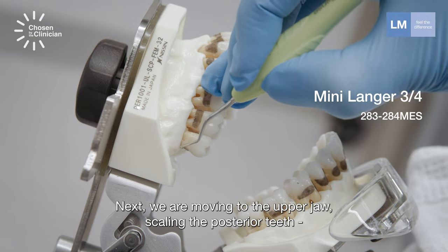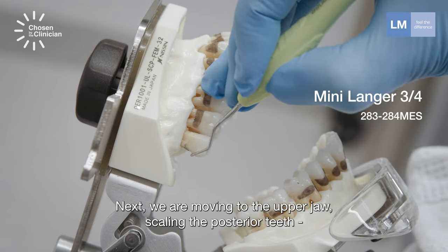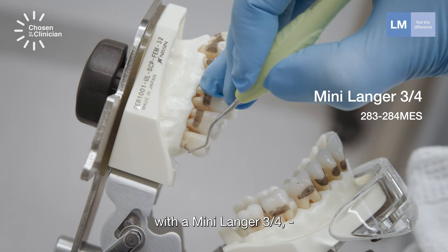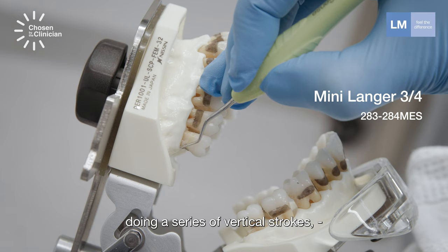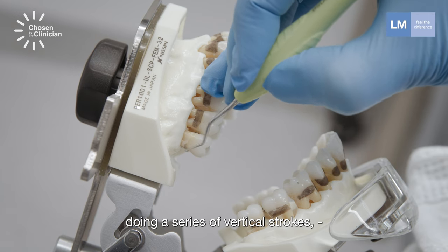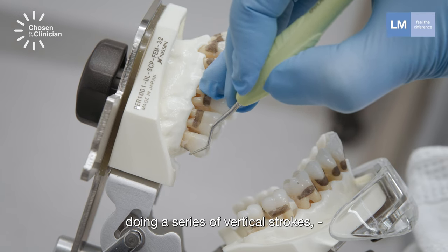Next, we are moving to the upper jaw, scaling the posterior teeth with Mini Langa 3-4, doing a series of vertical strokes.